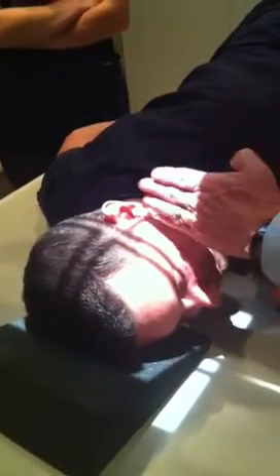So there's the ear hole. There's the infraorbital meatal line. So he's actually chin up just a little bit. So we need to bring that chin down just a tick, where this line is perpendicular to the front edge of the image receptor.